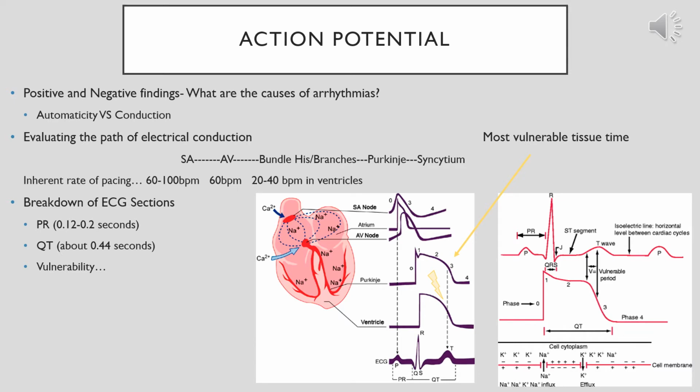QT interval, there used to be a set normal QT interval. However, your QT interval can be a little bit different based upon gender and body habitus. So when we're looking at QT interval, we really want to compare it to a previous normal. If you can have a baseline EKG for every patient, that's great, because a baseline EKG from when they're at their healthiest, at an annual visit, can give you a baseline as far as what's a normal QT interval for this patient, especially when it comes to prescribing medications.